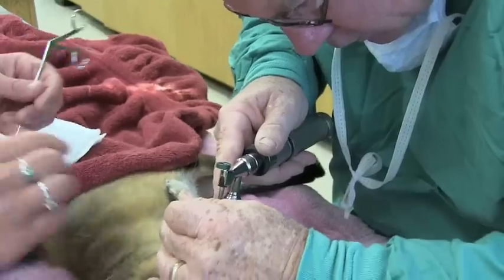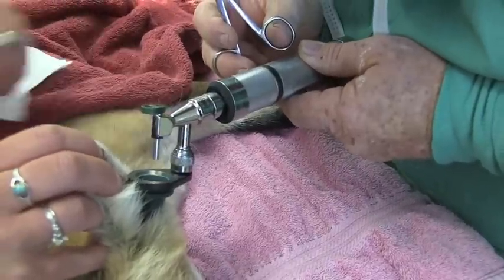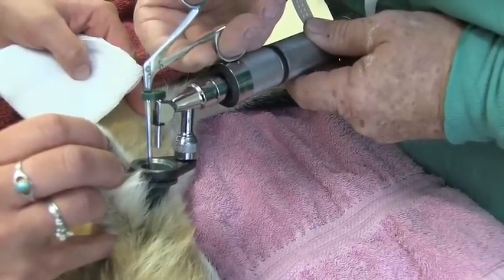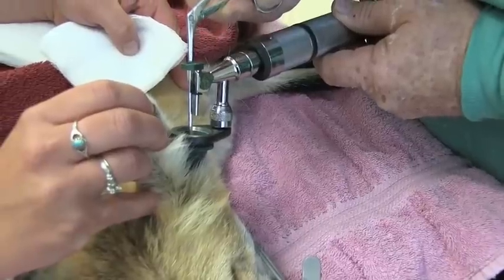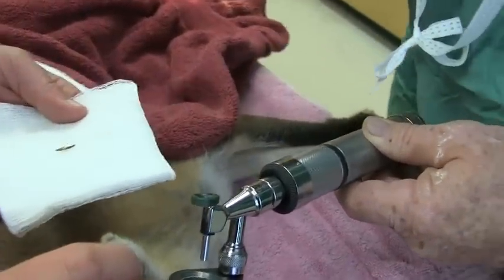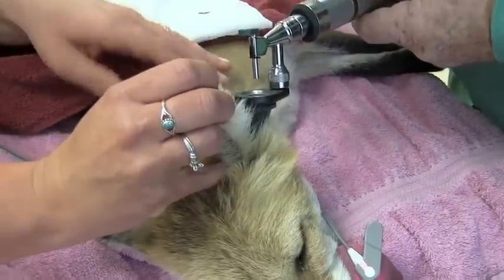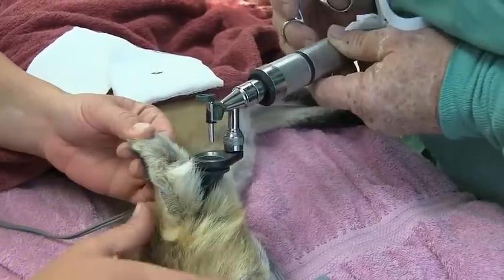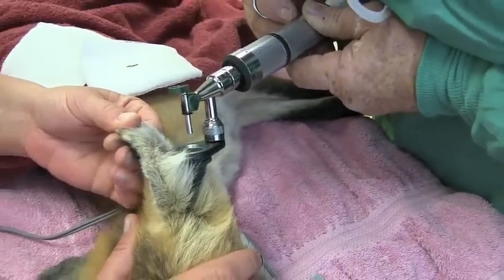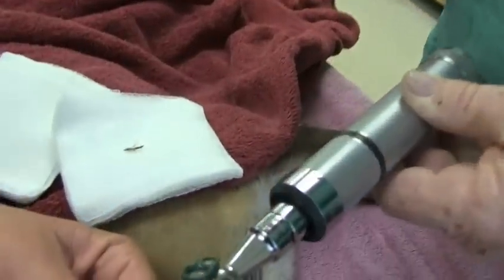Okay, Megan, can you hold that ear like that a little bit? And I'm going to go down here with these hemostats. See if I can grab this thing. We've got the fox under general anesthesia. There's a foxtail right there. There it is. So you can imagine how that would feel down in your ear. Even though we have the fox under anesthesia, you can see that it's shaking its head a little bit because these really bother them. I'm looking now to see if there's any additional foxtails down in there, which I do not see. So I think that was the problem. Simple fix.